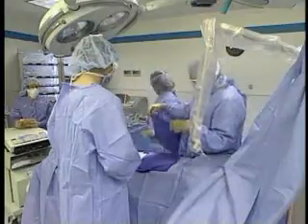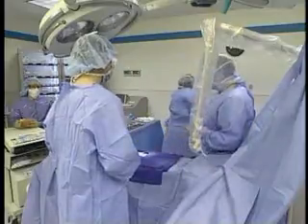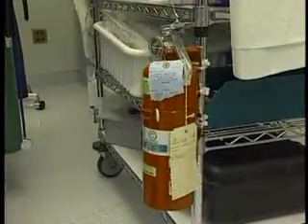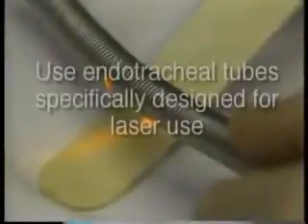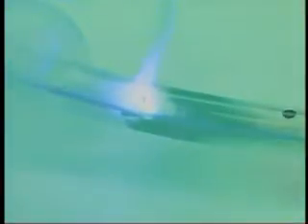An endotracheal tube used during laser procedures in the patient's airway or aerodigestive tract should be specifically designed to minimize the potential for fire. Standard endotracheal tubes are combustible and should not be used for these procedures. Lasers are high-powered electrical devices and carry the same risks as any other electrical equipment. Always check the wiring, cords, and water hoses if applicable. Never use the laser console as a prep stand or supply table, and do not handle the equipment with wet hands or near fluids that may be on the floor.